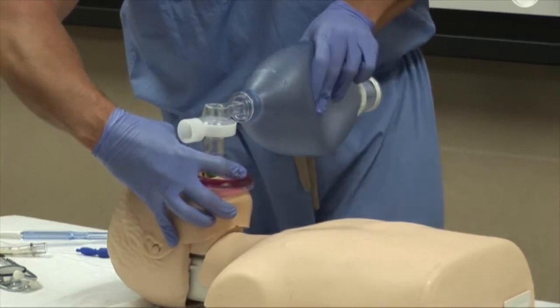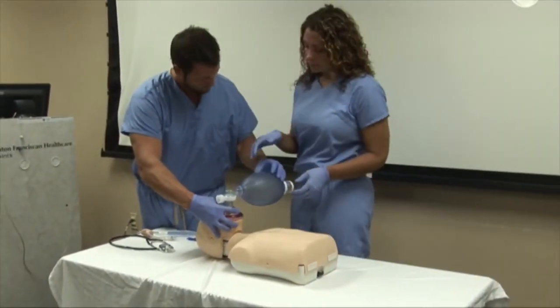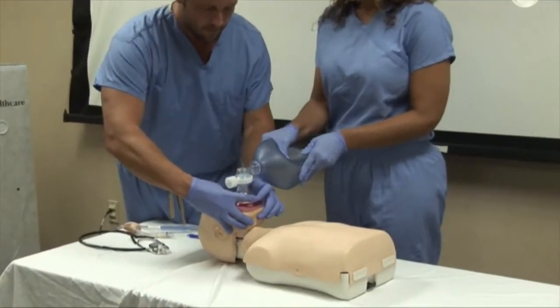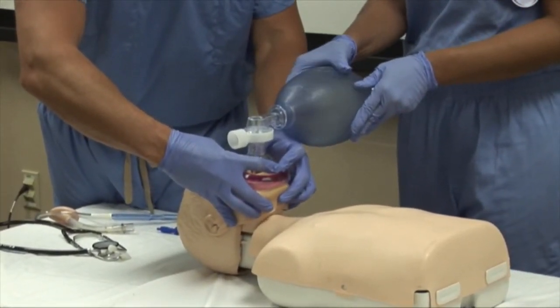If a second provider is available to assist in bag mask ventilation, one provider will deliver ventilations with the bag while the other provider provides the EC formation with both hands to the mask.